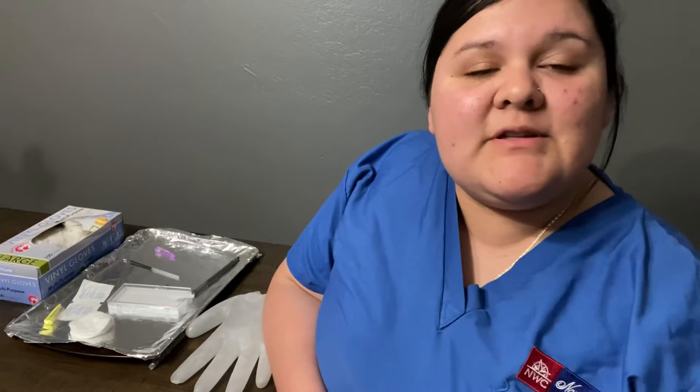Hi, my name is Clarissa. I'm a medical assistant and today I'll be talking about how to perform a finger stick and also what I will need.